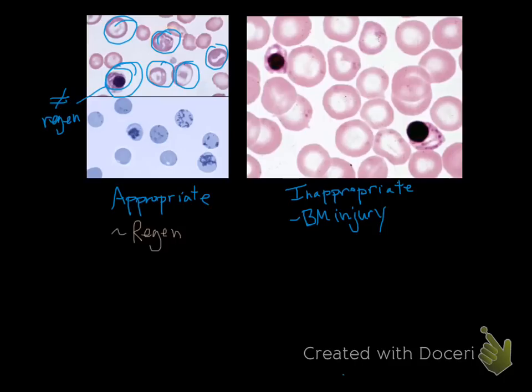Actually, this is a case in the picture of lead poisoning. There's increases in nucleated red cells and all these little stippled things in the red cell. That's called basophilic stippling. It's a poor picture. So lead poisoning, infiltration of bone marrow with neoplasia or infection, so bone marrow diseases. Bone fractures, weirdly enough. If there's a severe fracture, you can have release of some marrow particles, and nucleated reds can be seen in circulation. And then splenic disease, recent splenectomy, because the spleen removes nucleated red blood cells. A very specific subset of nucleated red blood cells that are increased, where you'll see very immature forms, are erythroid leukemias, but that's exceedingly uncommon. We mostly see it in cats.